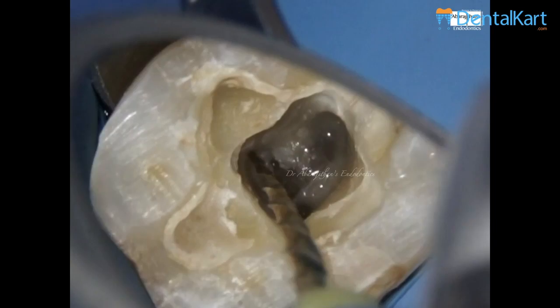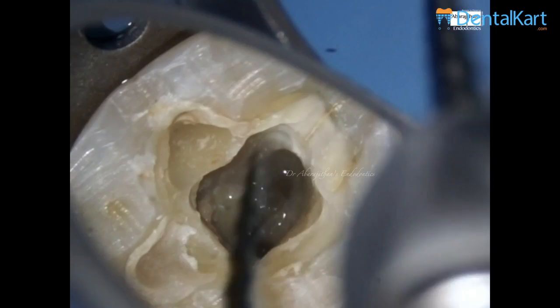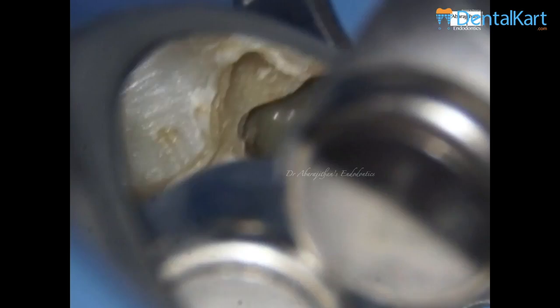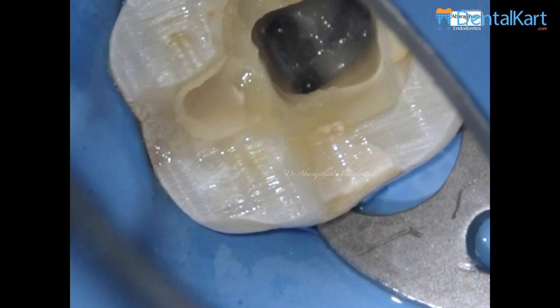I just located the canal orifice with the DG-16, following which we are going to use the orifice shaper. I am first using it in the mesolingual canal — you can immediately see the pus discharge from the canal. We wipe the file, clear the flutes, and then go to the next canal, the distal canal. Not overdoing it, just brushing in the coronal third. After coronal enlargement we do ultrasonic irrigation, and this is the primary preliminary access.